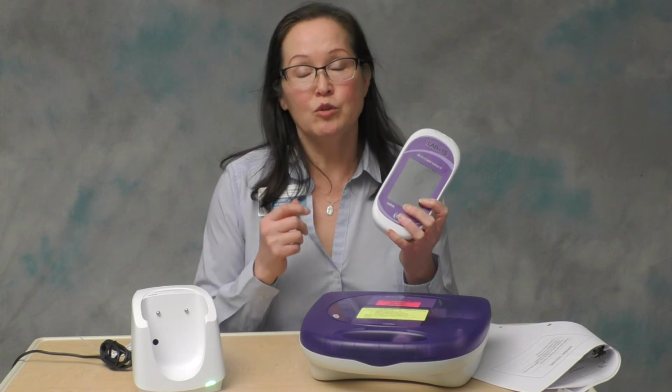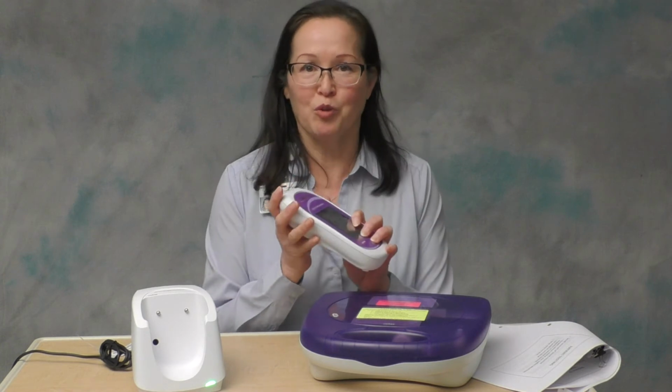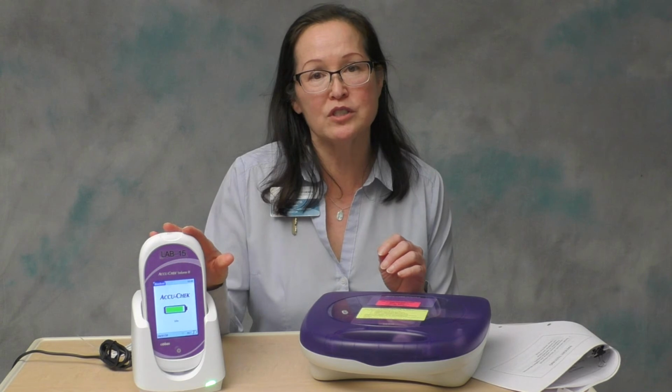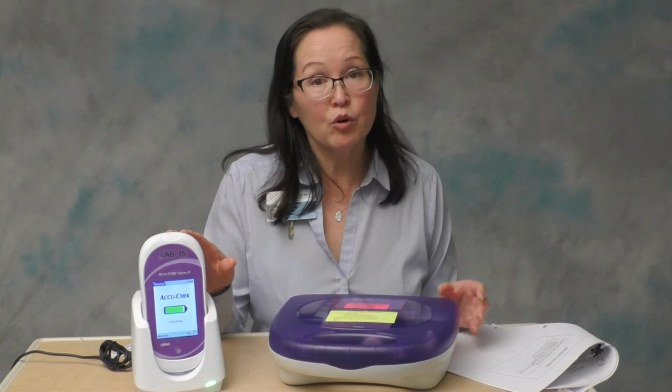You cannot use an earlobe stick or a forearm stick, or a toe stick. Those are all questions that I've had in GNO. So just to clarify that, only a finger stick or a neonatal heel stick. You may not use umbilical cord blood.